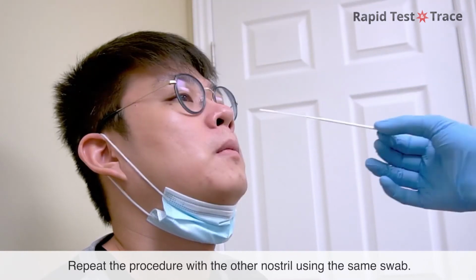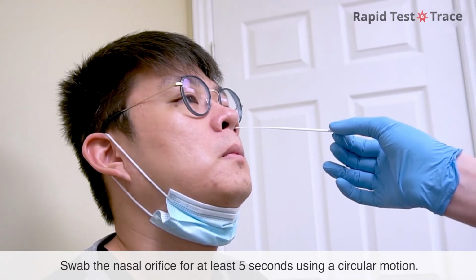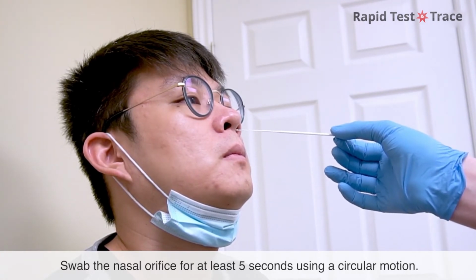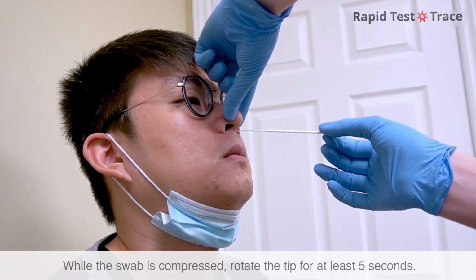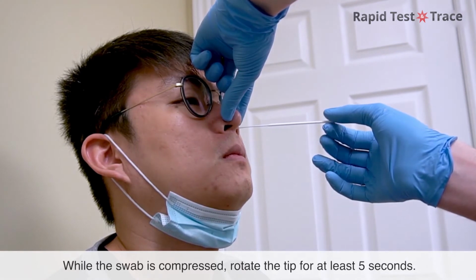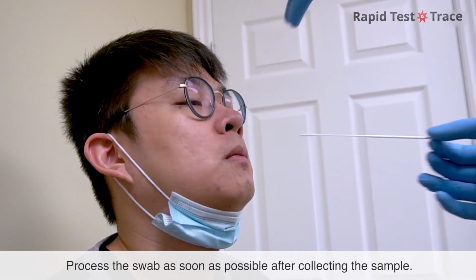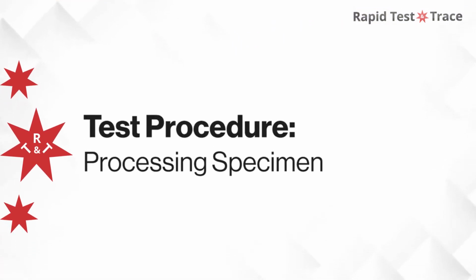Repeat the procedure with the other nostril using the same swab. Swab the nasal orifice for at least 5 seconds using a circular motion. Press the patient's nostril against the swab. While the swab is compressed, rotate the tip for at least 5 seconds. Process the swab as soon as possible after collecting the sample.